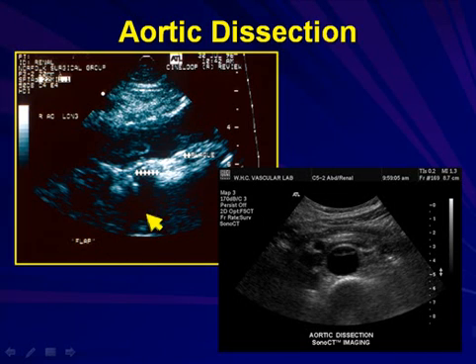This patient had recently undergone a renal intervention in which a catheter was approached in this direction. There's a large mound of plaque here, and when the catheter hit that plaque, it was forced downward and lifted the intima. And this was during certain portions of the cardiac cycle, waving and opening and closing. It was not causing enough of a hemodynamic impact to address it at that time.